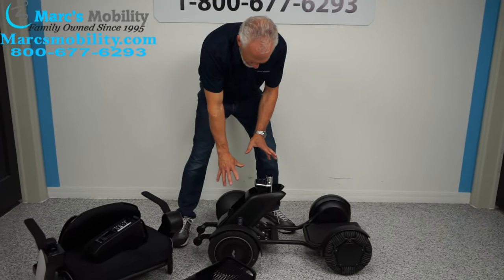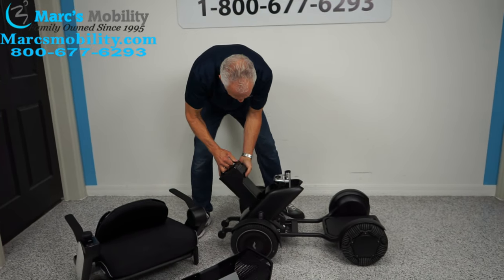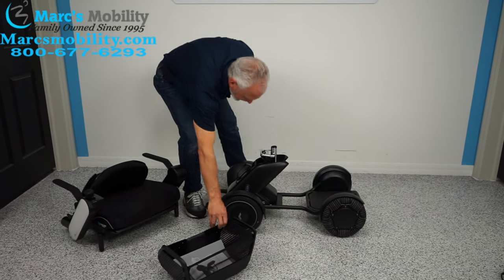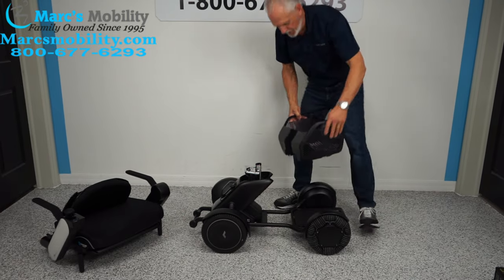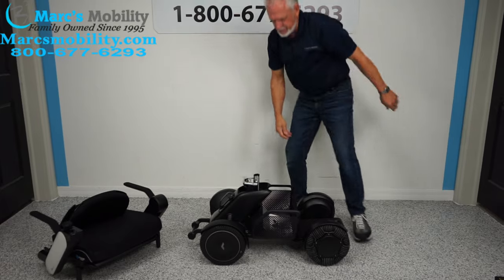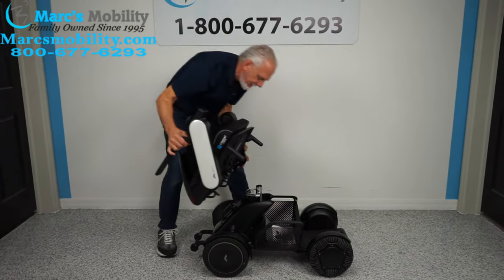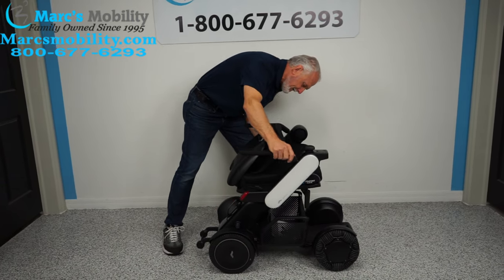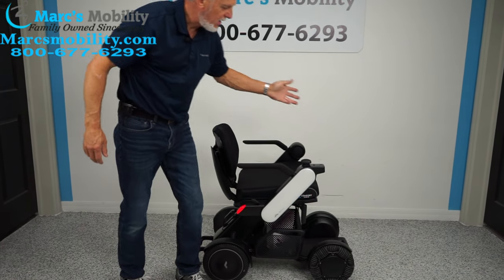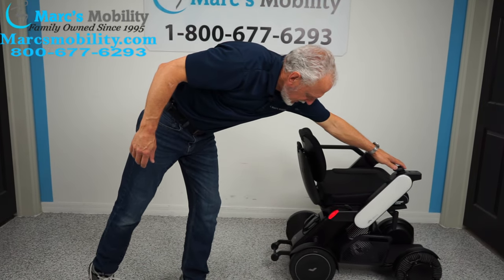Never put the battery pack in until the base is assembled. Once the base is together, slide your battery pack in and it snaps right in. Put your basket on first — it's going to be a lot harder to put it on afterward. Then grab your seat, turn the power back on, and the chair should move forward and reverse.